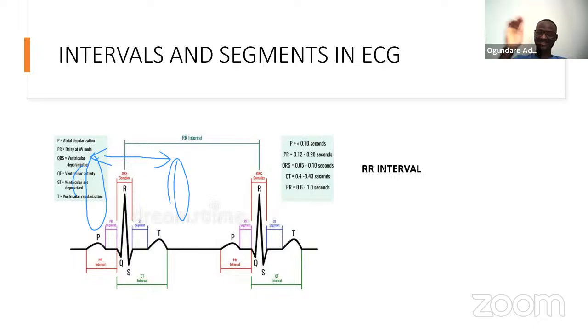So there is a limit to how far your scope of sight is. From a distance, one way you can actually see, okay, this patient's heart rate is dropping, this patient's heart rate is increasing, is understanding this RR interval, just making sense out of the RR interval.